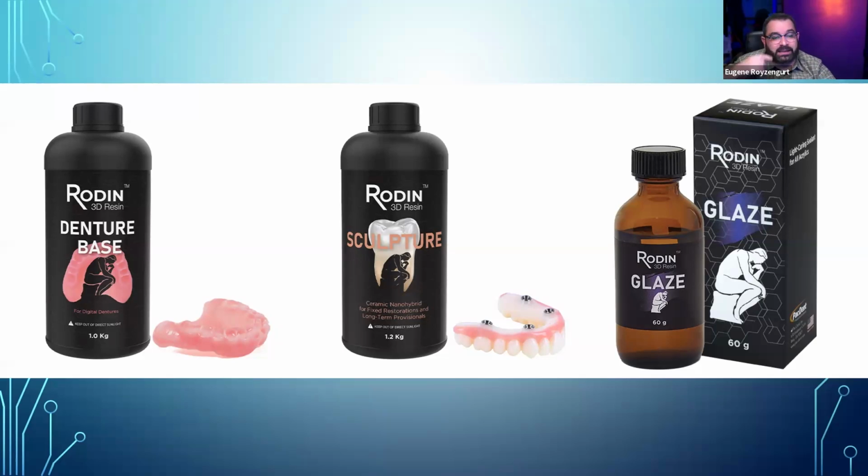Okay. So basically what I did for a bunch of these temp cases is that I will print the denture teeth out of Sculpture or out of Titan. Usually the denture teeth I will print out of Sculpture. Titan is what I usually use for hybrids. And then I will bond the teeth to the denture base using either the denture base material, or you can actually use the glaze to do that. And it works out great and it bonds really well.